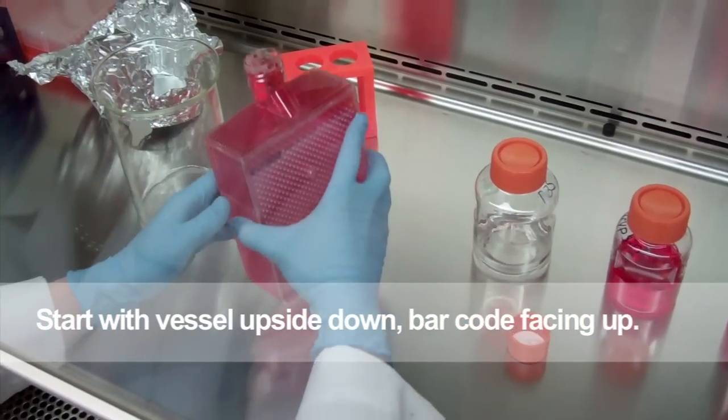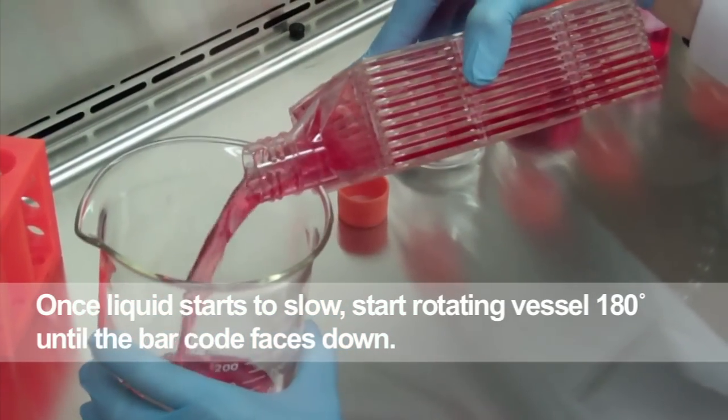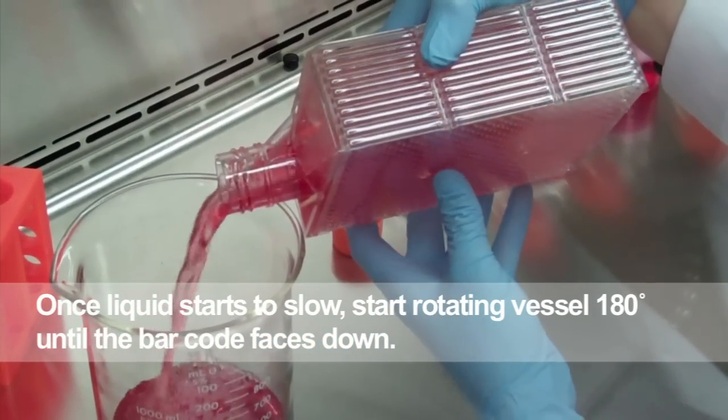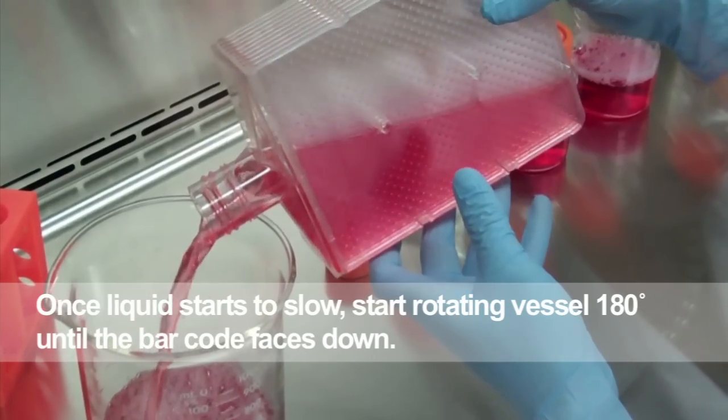When pouring, start with the vessel upside down or the barcode facing up. Once the liquid starts to slow down, start rotating the vessel 180 degrees until the barcode is facing down.